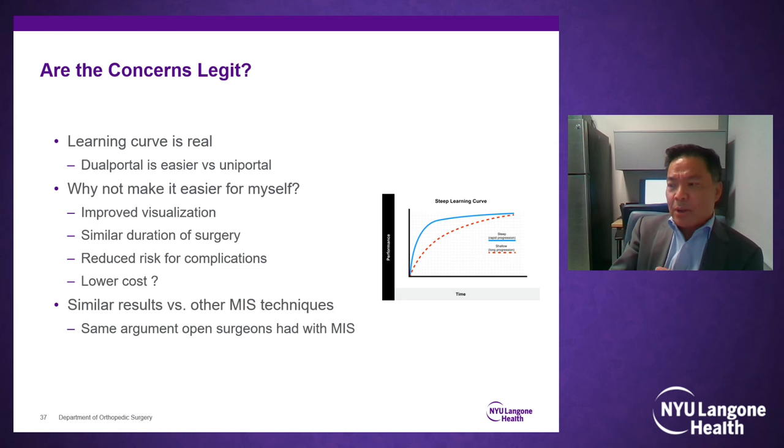So the concern, however, regarding endoscopic spine surgery is real. The learning curve is there, but it's not that bad. Dual portal is not that bad. If I could do it, you could do it. And you just need to invest some time. You need to visit some people that have done this, have some good experience, and then do a couple of cases on cadaver, and you could really get started. And I could tell you the visualization that you get and the degree of versatility that you realize with endoscopic surgery is tremendous once you get the hang of it.